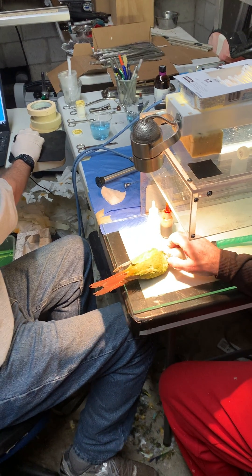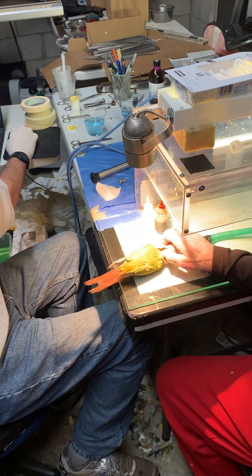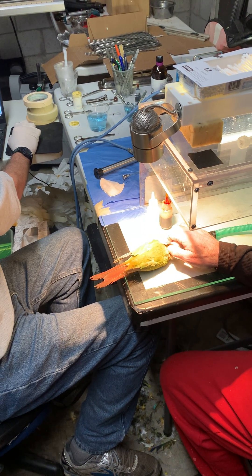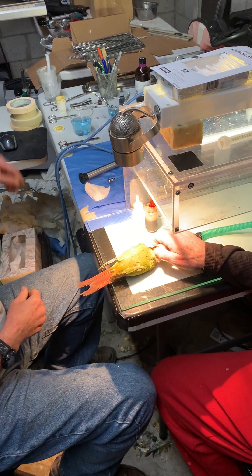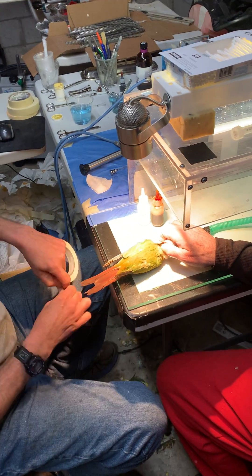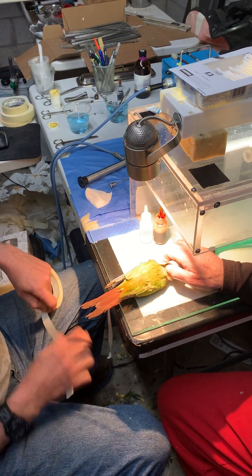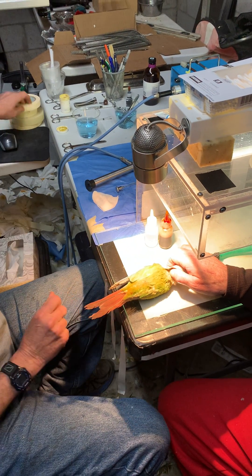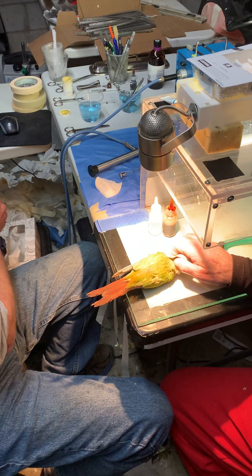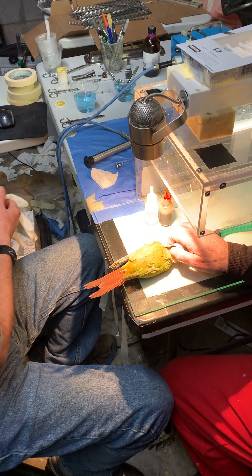The process is to surgically sex a bird. This allows you to look at the gonads and quickly get an idea of its health status. I wanted the whole procedure to be seen for the AK vets to be able to perform this there. I'll explain the different steps.